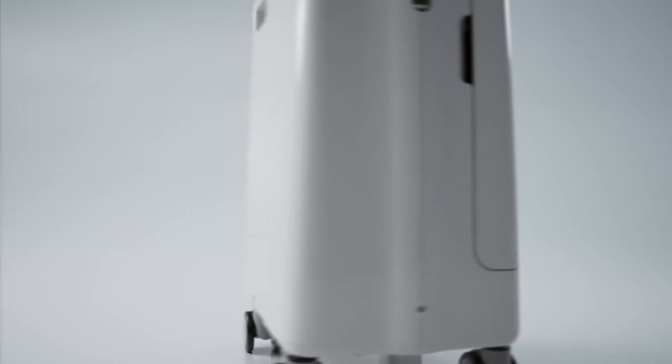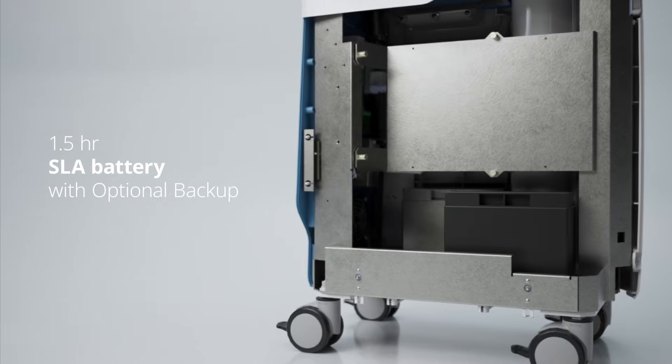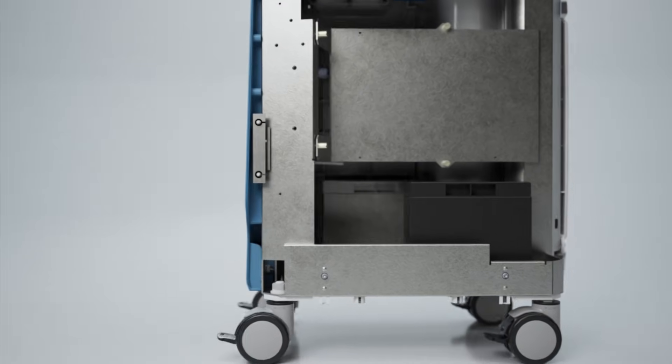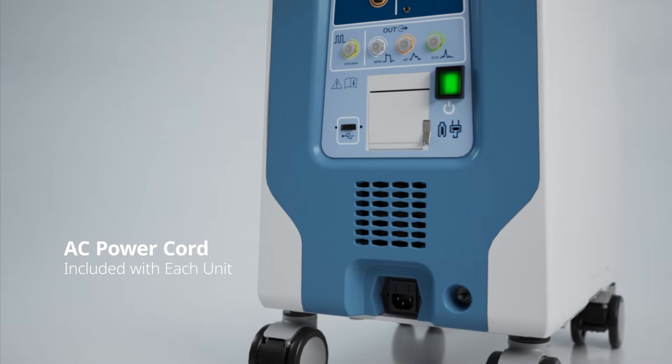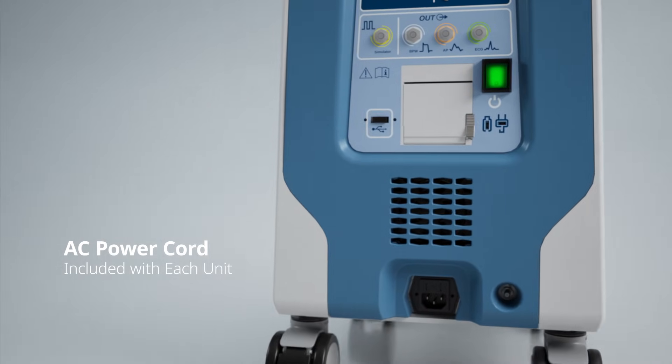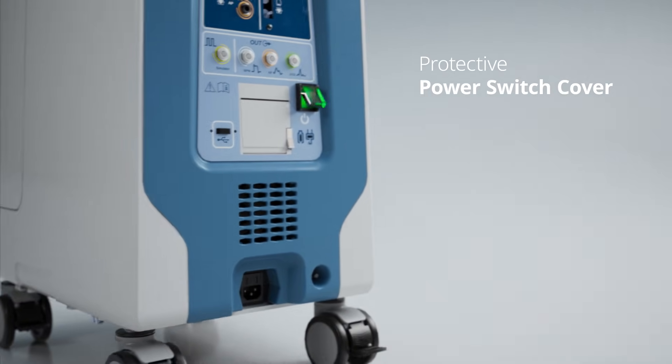The unit features a 1.5-hour SLA battery for dependable power and the option to add a backup for added security. Plus, an AC power cord included with each unit for inverter connection that charges while in use, and a protective power switch cover to prevent inadvertent interruptions.